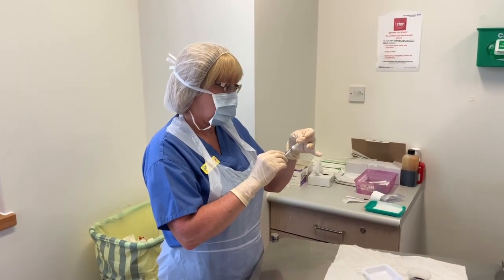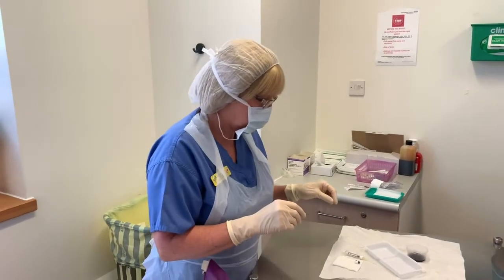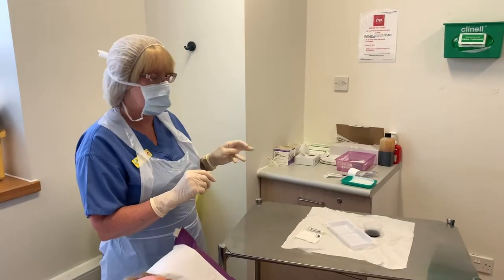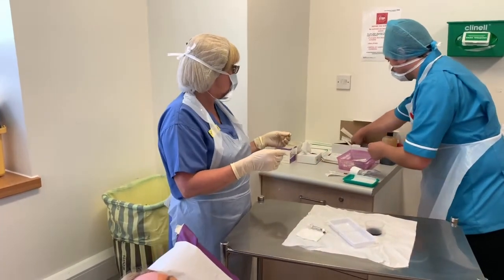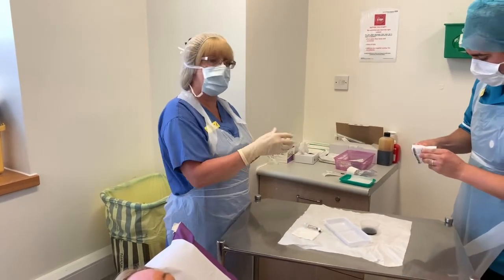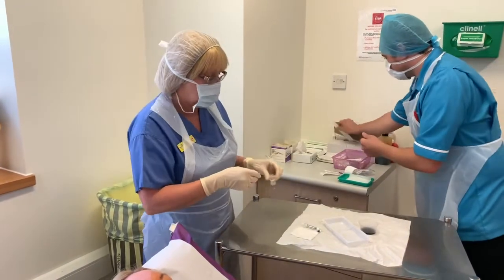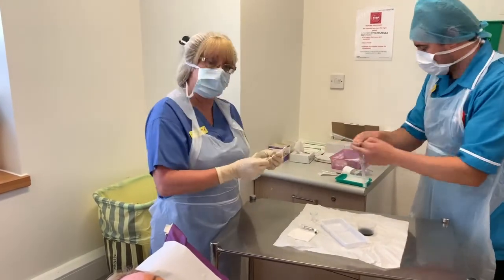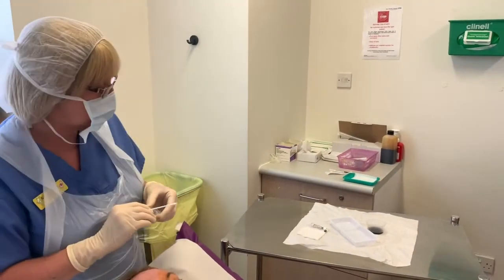So is that a Lucentis pre-filled syringe? Yeah, this is the Lucentis pre-fill. And do you think having a pre-filled syringe helps? I actually prefer the one which is not pre-filled. Really? Yeah, I do. That seems to draw out better, although it's more viscous, it's thicker. I just quite like to draw it up. You don't mind preparing your own solution? No, I don't mind it. It doesn't take that long, does it?